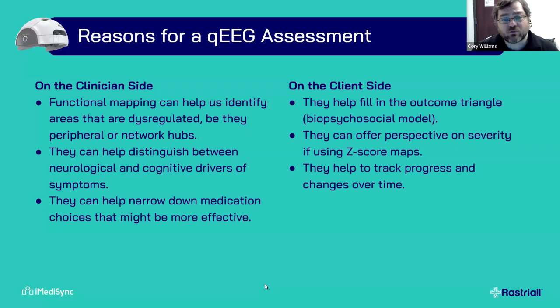I work in mental health, and I could not imagine running this clinic without looking at brain data. We use it to identify training targets or treatment targets. We use it to help distinguish between whether symptoms are caused by neurological dysregulation or cognitive issues, right? And as you all know, I'm sure, the thought process is an important piece to all this. For some folks, they need help with the brain and the thinking patterns. For some people, it's one or the other. And so the EEG can help us to figure that out.